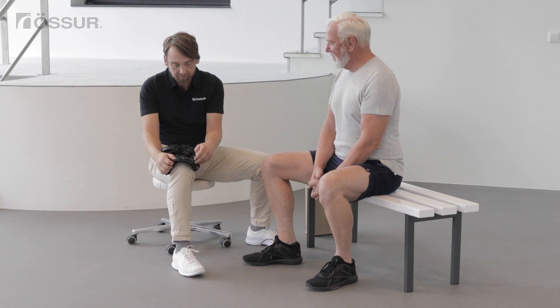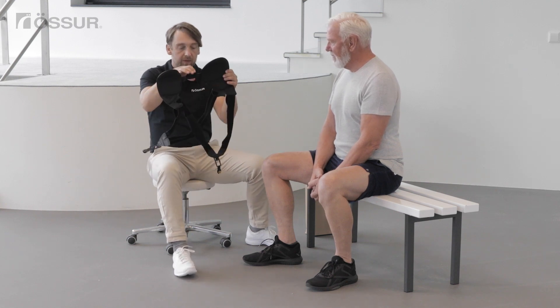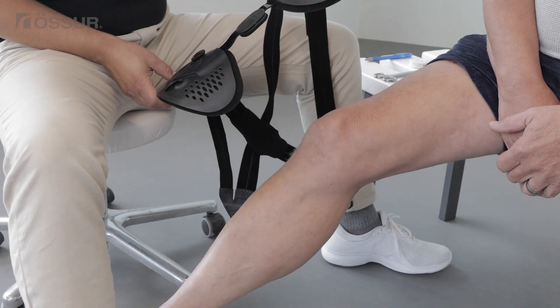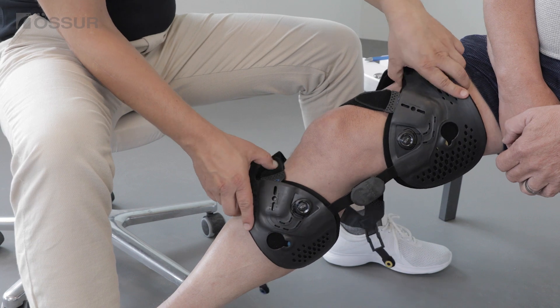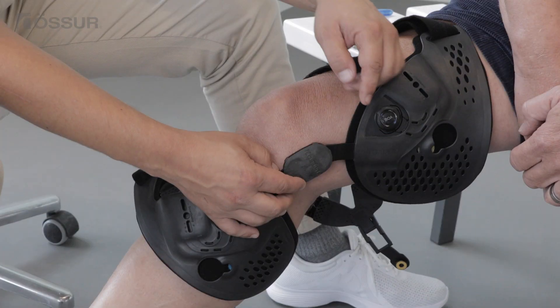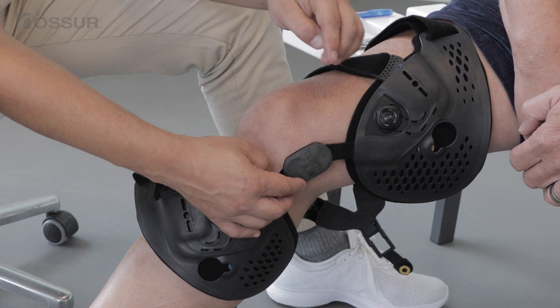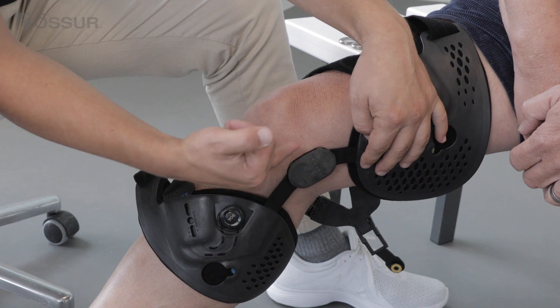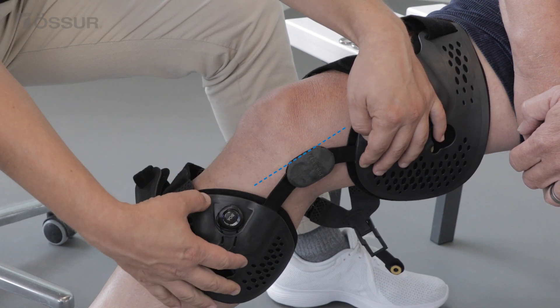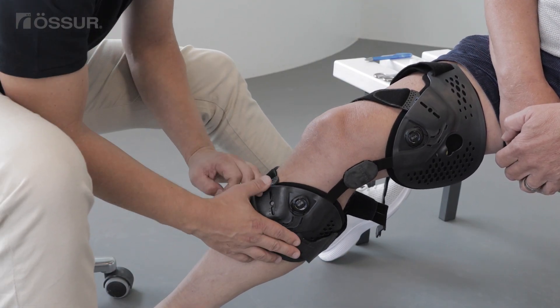Open upper and lower quick fit buckles. Position the brace on a partially extended leg with the user sitting down. Align the Össur logo with the upper edge of the knee cap. The front edge of the hinge should be at the mid line of the leg when looking from the side. Place the button of the blue quick fit buckle into the blue keyhole and close.